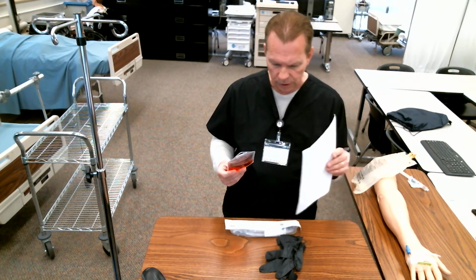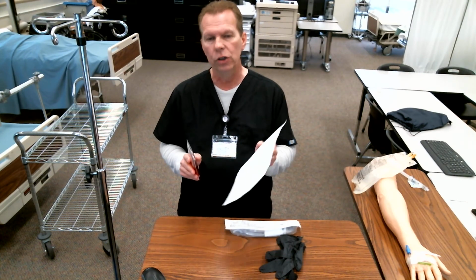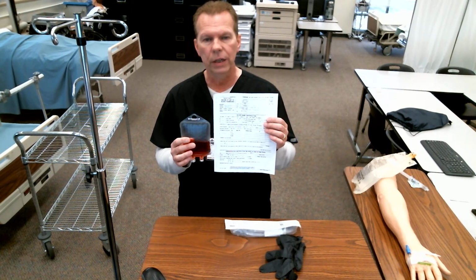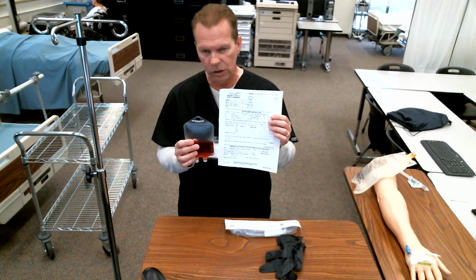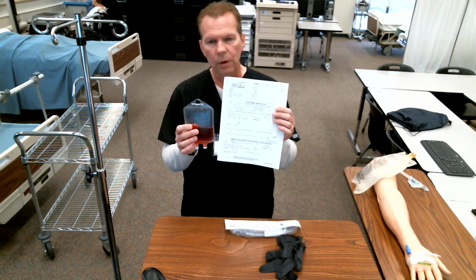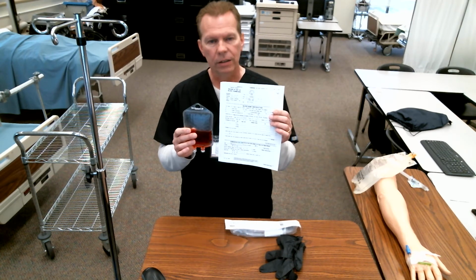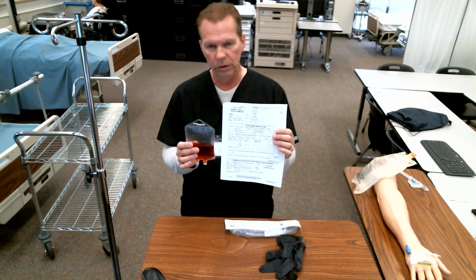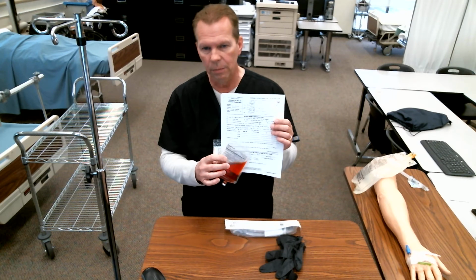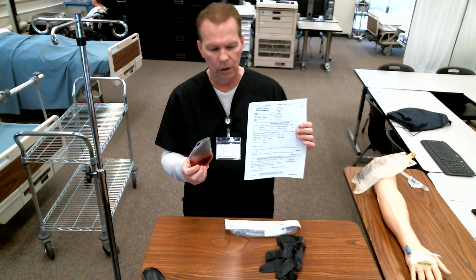But once we do this and when I've signed for it, I'm going to go back and get on the unit and do a second check. So I'm going to get with another licensed personnel and recheck all of this information that I just checked. So this is check number 2, all right? And we don't want to skip it. We want to make sure that we do this because we may have made a mistake with the lab person, and if we have, we want to catch it before we do something wrong. So we're going to verify all of these numbers and the patient's name and all identification and make sure it matches with the label on the blood.